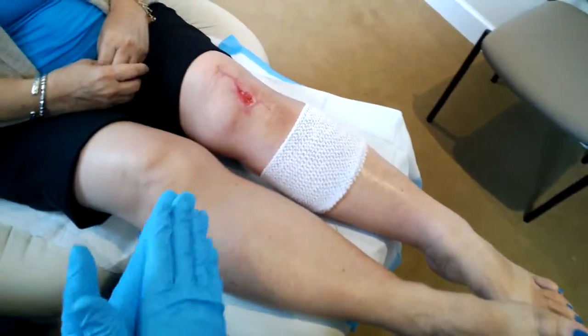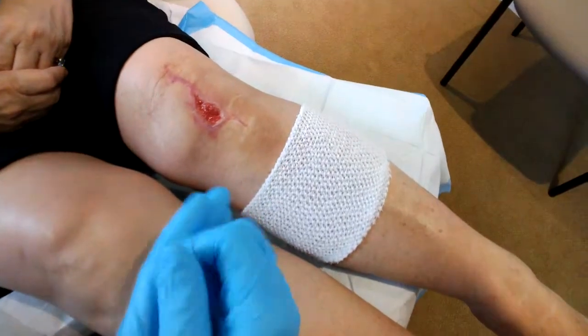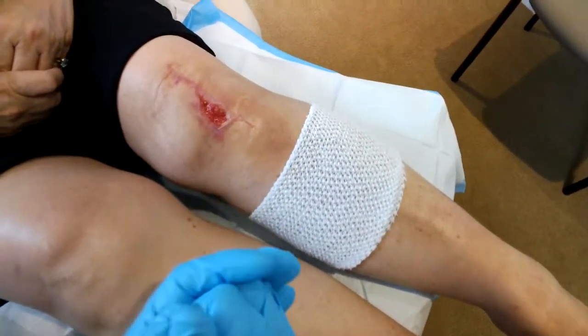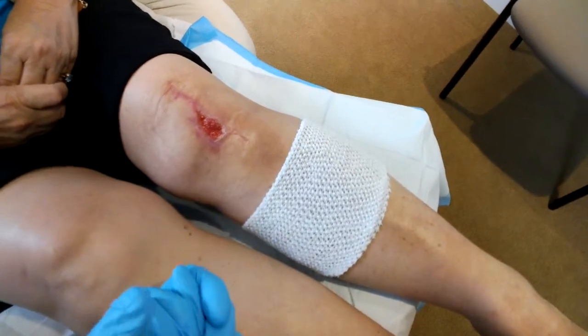Dr. Creighton here. This is our patient's leg. She has a wound here that will not heal, so we're going to debride the wound and put on a special device called a wound vac.